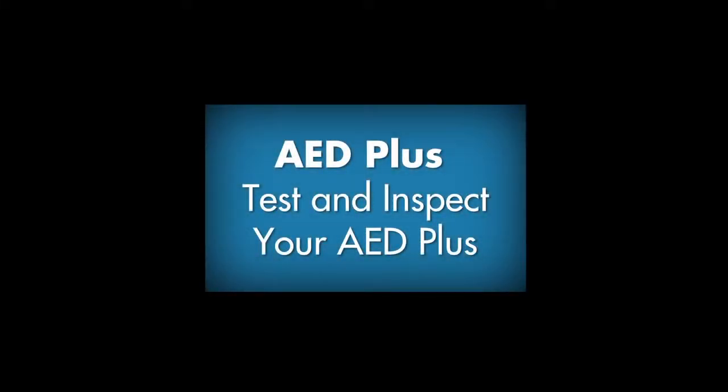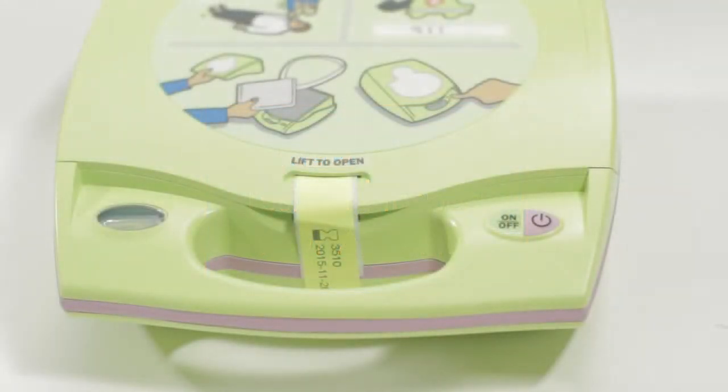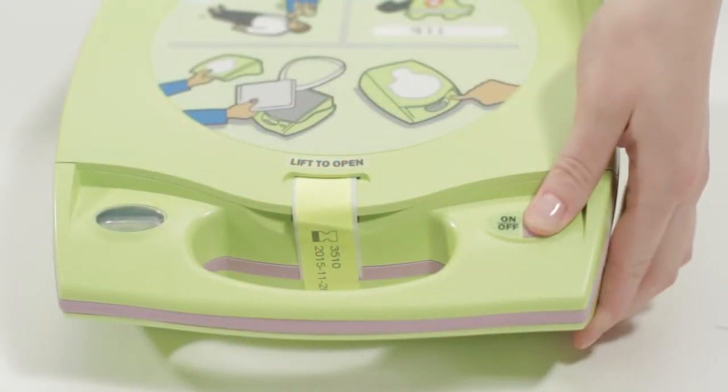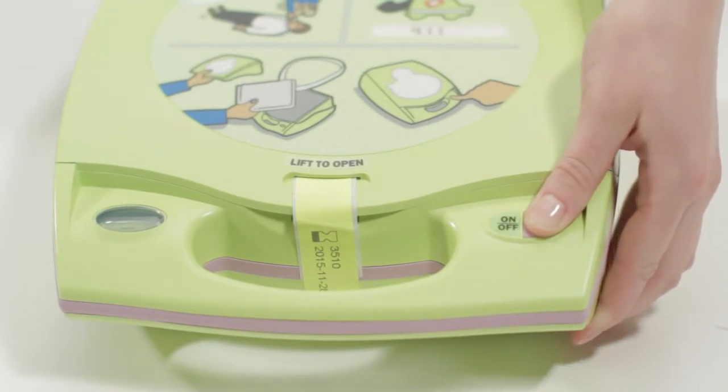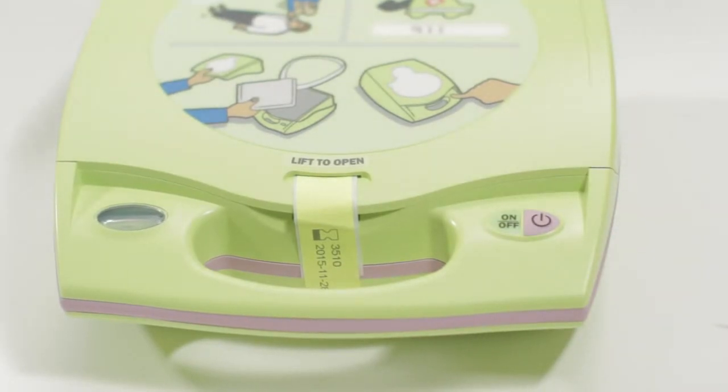To complete the setup of your AED Plus, you'll need to perform a manual self-test. Perform a manual self-test by holding down the on-off button for about 5 seconds. When you hear a click, let go of the button. The self-test will take approximately 15 seconds to complete. Unit OK. This indicates your AED Plus passed the self-test. Initiate this test whenever you wish by merely holding down the on-off button for about 5 seconds.